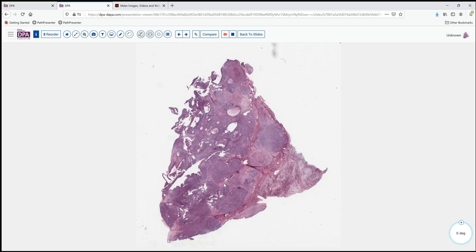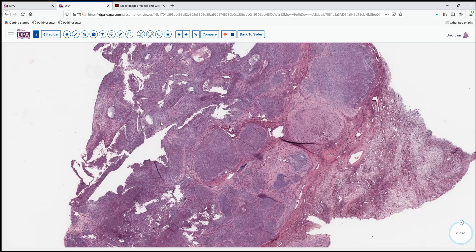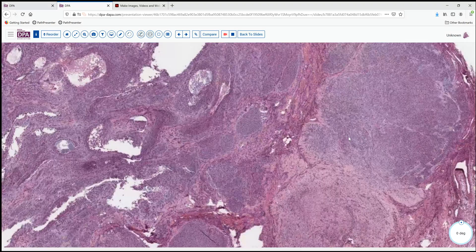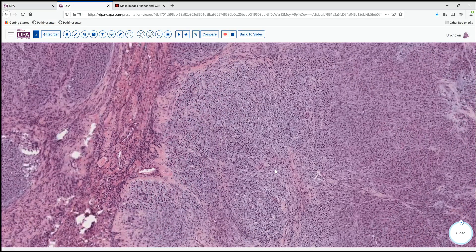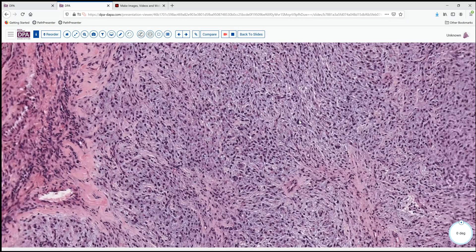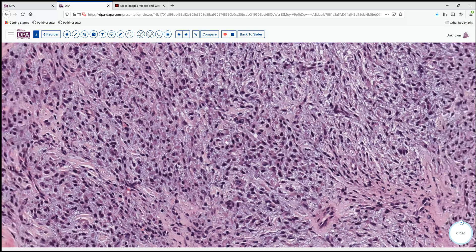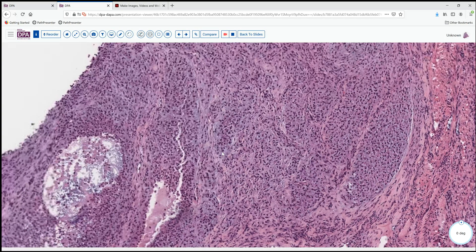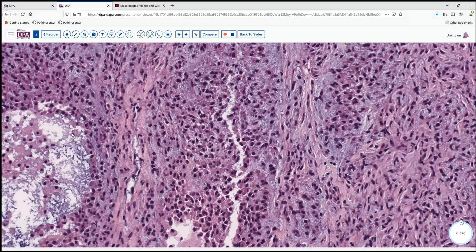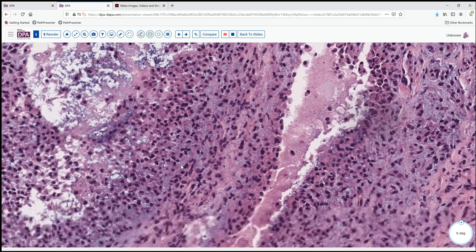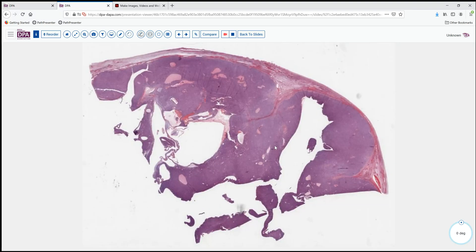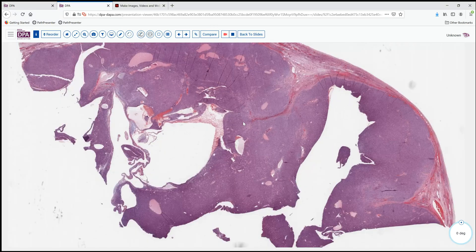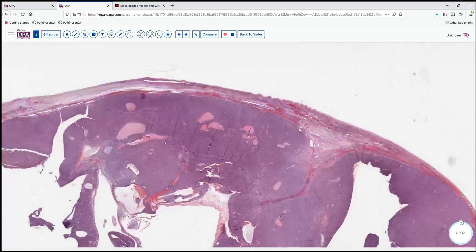Here's a nice section of our permanent tissue from the frozen section block. We again see this follicular architecture and a diffuse pattern. Here the cells look a little more cellular and larger. In the intervening tissue we can still see some frozen section artifact, but there is fairly abundant cytoplasm. We are not deceived in our frozen section impression that this was probably some sort of sex cord stromal tumor, but a definitive diagnosis will be difficult on this frozen tissue processed by permanent section. So let's look at another section with more routine fixation. Here we again see these large follicular structures, some filled with fluid, others emptied out, and a diffuse pattern in a somewhat vaguely nodular arrangement.